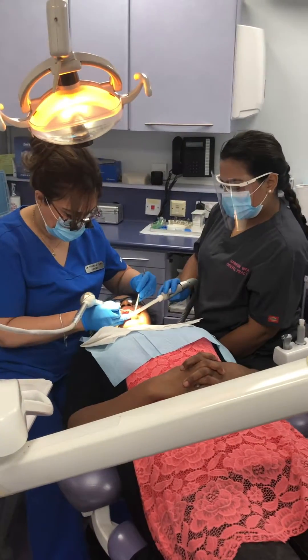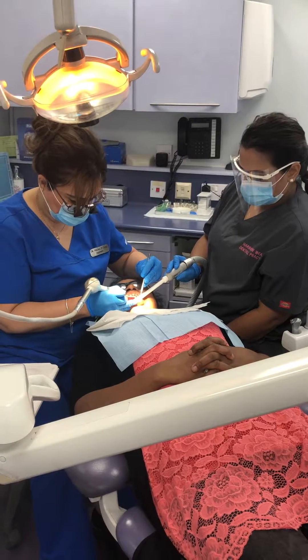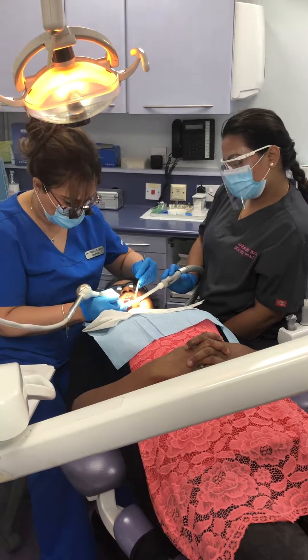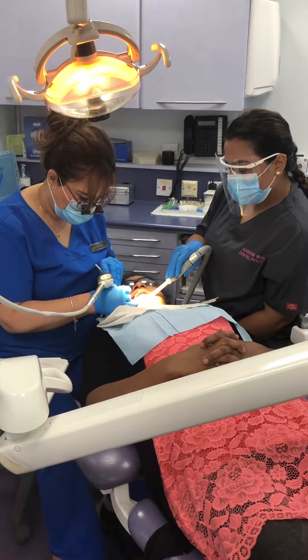So in this lady, she's got deep pocketing. We've done some deep scaling and root surface debridement, and now we're just finishing off by using Periomate around these pockets for her.